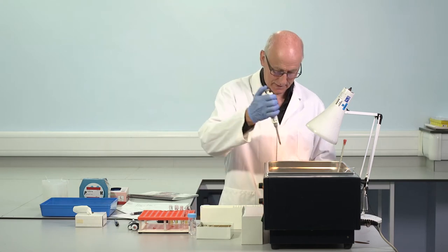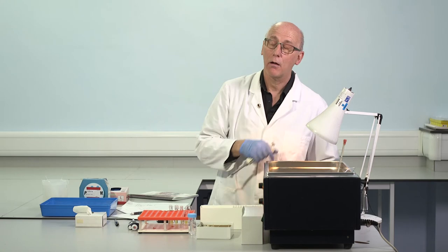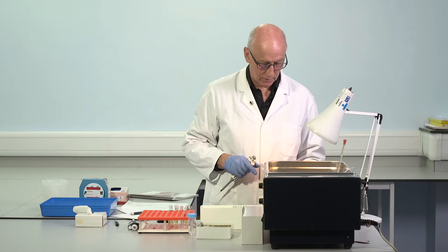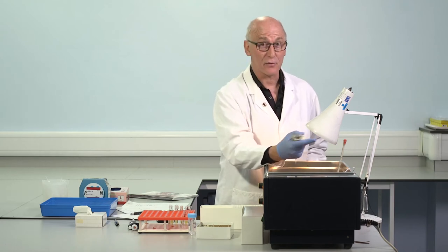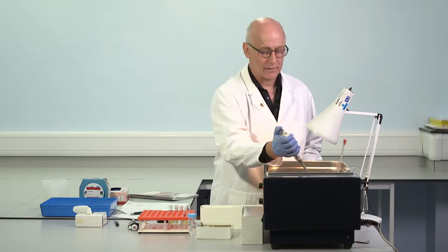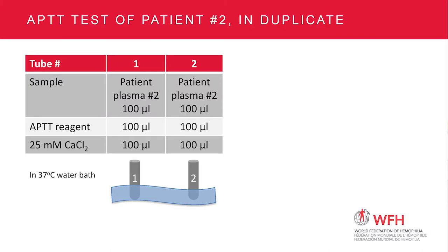So exactly on 3 minutes. When APTTs are run on automated systems, there's usually some tolerance. So even though we set the protocol on the system to add the calcium at 3 minutes in this case, on most analyzers there's some tolerance. It might be plus or minus 5 seconds, that kind of thing. And in fact, this has very little impact. So although I'm carefully timing this, 2, 3, 4, 5 seconds has a pretty minor impact on the results that we'll obtain.